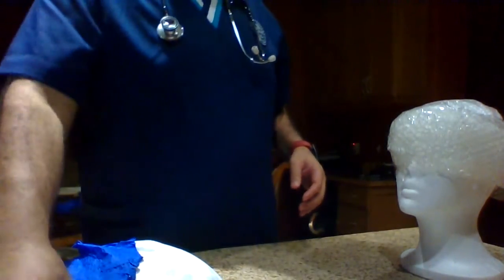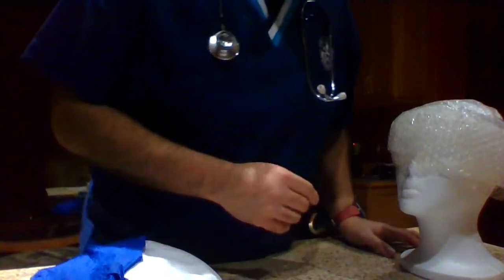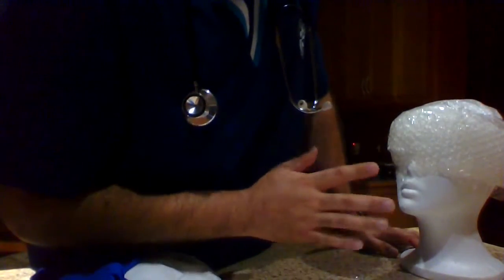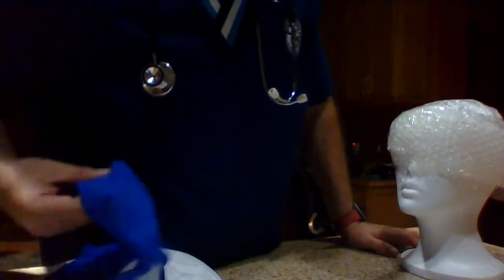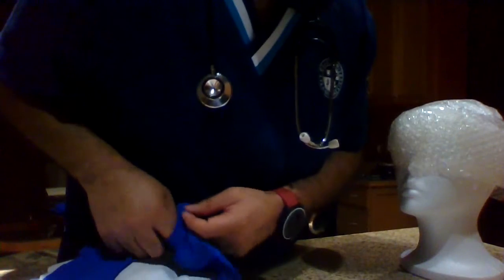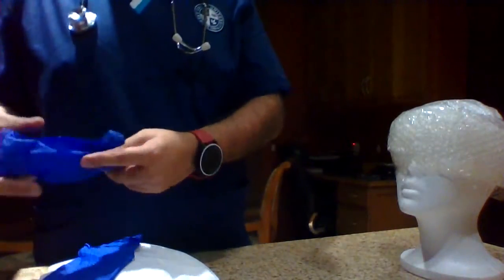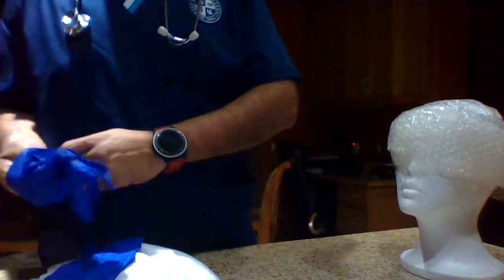So before we begin, we're going to hand the patient a tissue, and we're going to ask him or her to blow their nose. So now we're good. Now we need to obtain the appropriate equipment for NG tube placement. So let us begin that part.